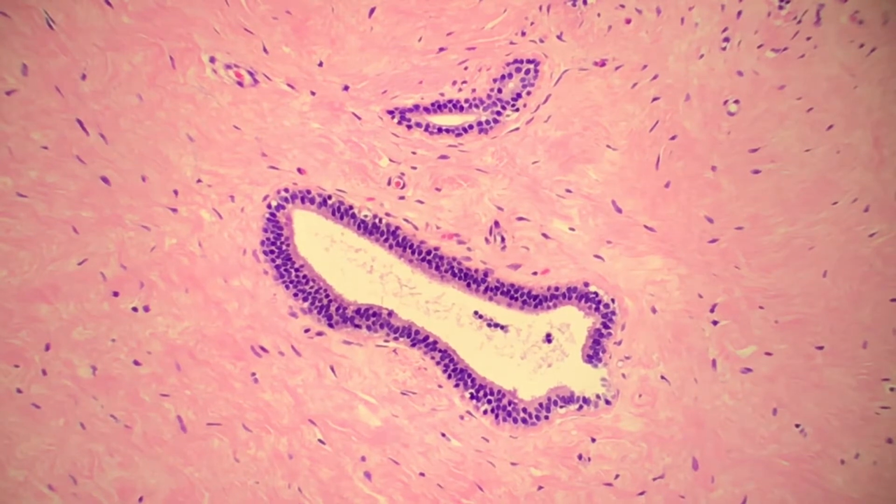You can search through this entire case, all 8-10 slides of it, however much is in there, and what you won't find really, though, is mitotic activity within the stroma. Okay, and that's something to keep in mind. That's very important, because that helps you with your differential. If you do find an occasional mitotic figure, that's okay. That doesn't make this not a fibroadenoma, but the mitotic activity should be very low even if you do see mitotic figures.